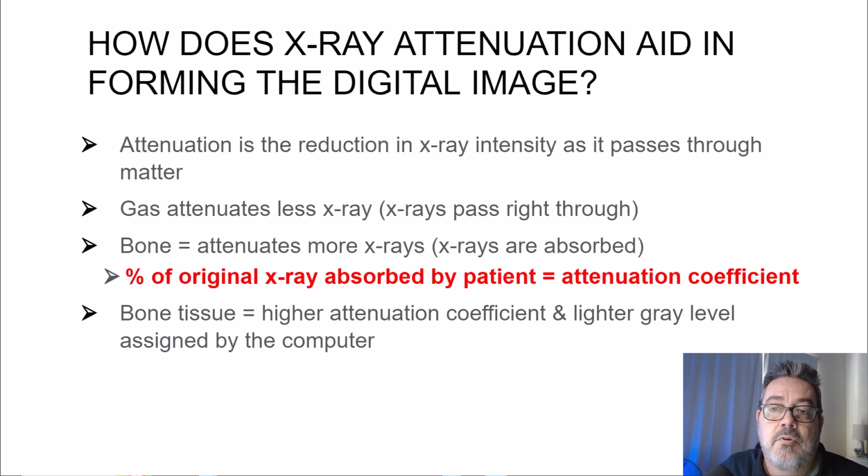Also, the percent of original X-ray absorbed by the patient is referred to as the attenuation coefficient. It's affected by subject contrast and tissue density, but can also be influenced by the technical factors you select. Don't just be a button pusher.